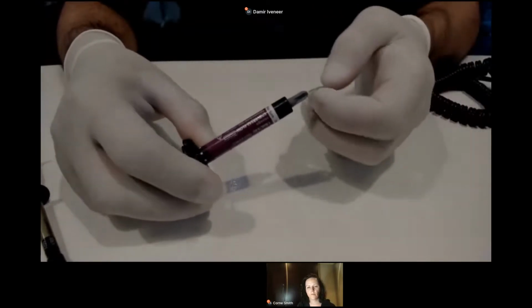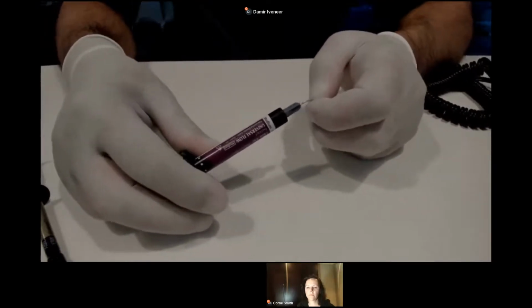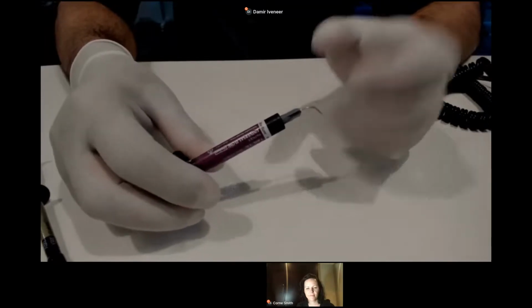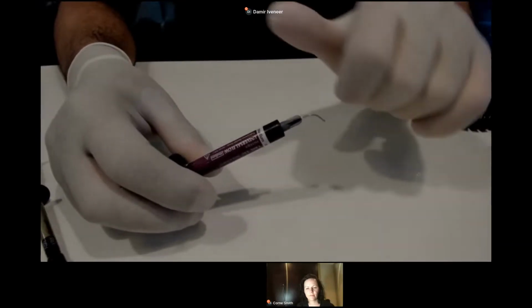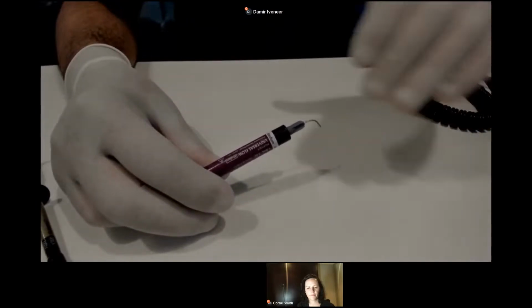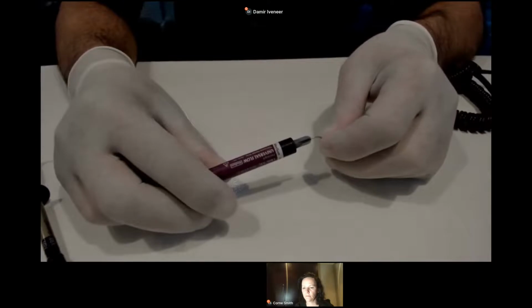For the palatal shell, personally, I use a transparent enamel shade. But you can also use the opaque shade. This is good enough. I know, Corey, that you use the opaque shade, right? For the palatal shell. Yeah, a combination. A combination. So this is good enough, but make sure that the layer of the palatal shell is very thin. And on top of it, later on, you can put another opaque. And this opaque shouldn't go all the way to the incisal area, because if you want some characterization, you should put something which is transparent. So half a millimeter before the incisal area, use the opaque, but also use some transparent.